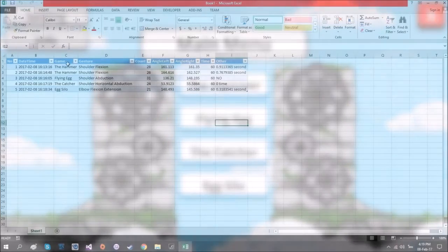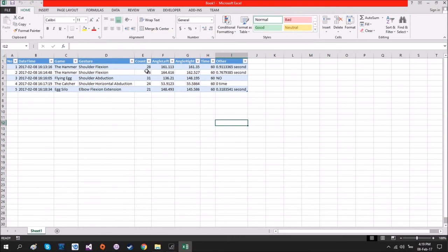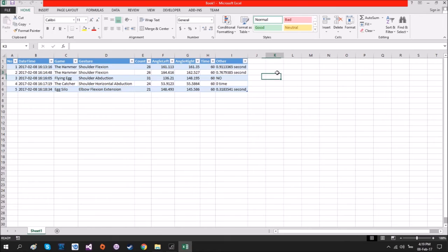This is the sample of the user's progress data. The progress data consists of the date when this data was recorded, the game's name, the action's name, the action count, the average angle of the left and right, the playing term, and other specific information for each game.